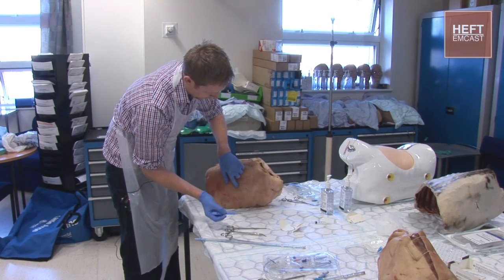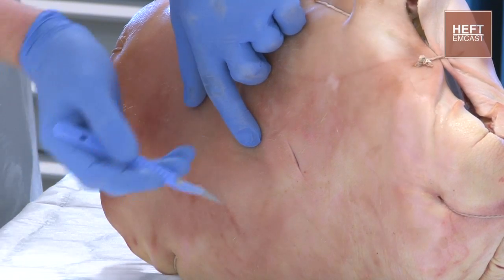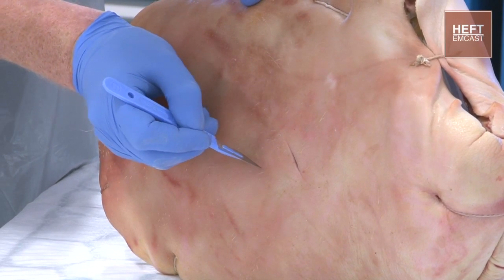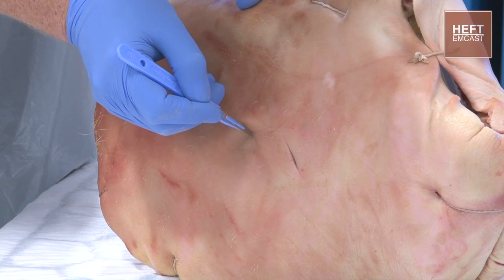We're then going to make an incision over that point. The important part is to make sure it's wide enough to get our fingers and our drain in. In the intercostal space, make a generous enough incision.